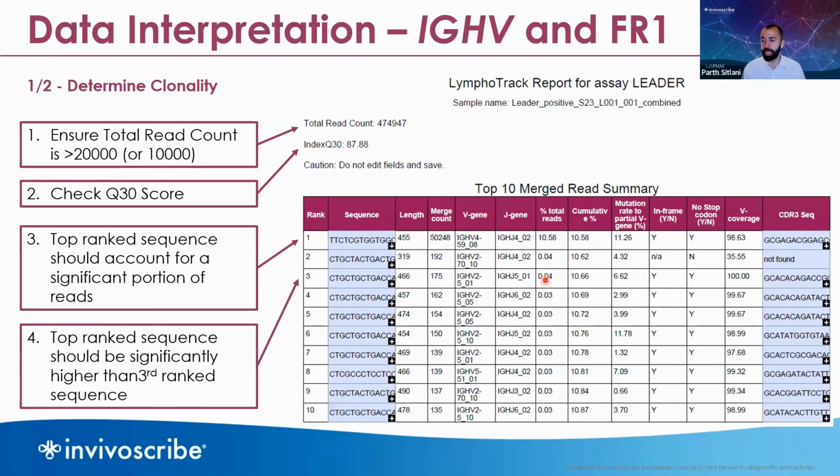And when you have that oligoclonal plasma cell population, you'll see all of these percentage total read samples be a little bit high for the most frequent sequences. So as I mentioned, maybe 8, 6, 5, 4, 3, 2. Those rearrangements would fail that second criterion for a clonality detection, and you could maybe use one of the more advanced interpretation criteria to really call that oligoclonal.